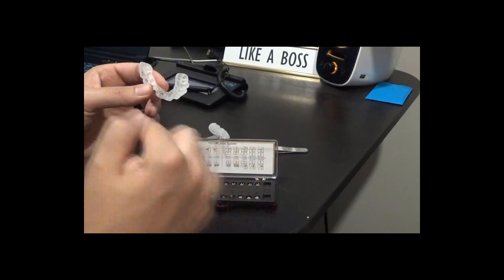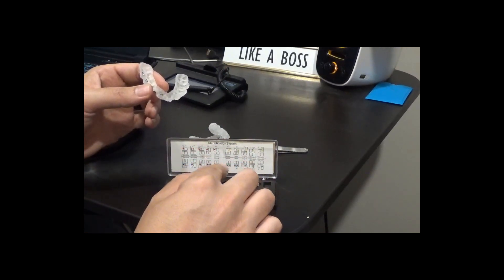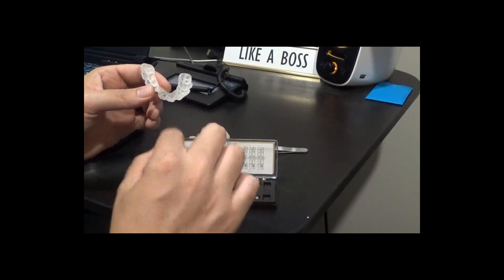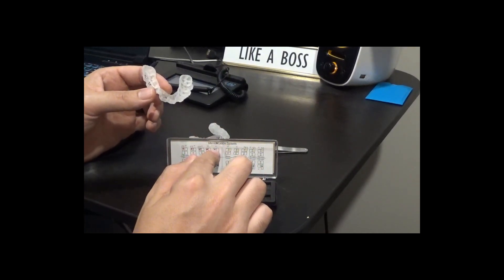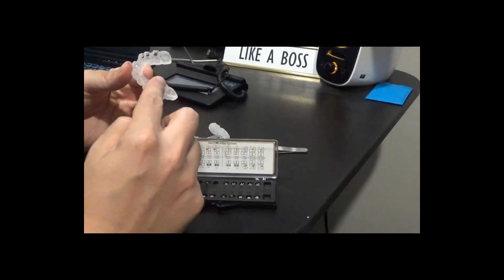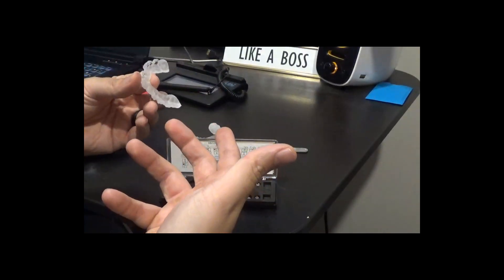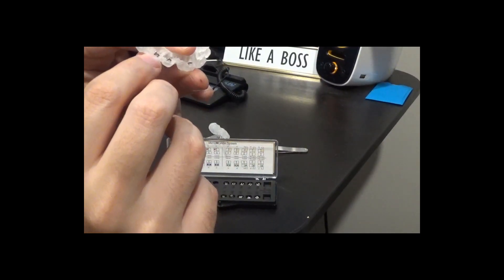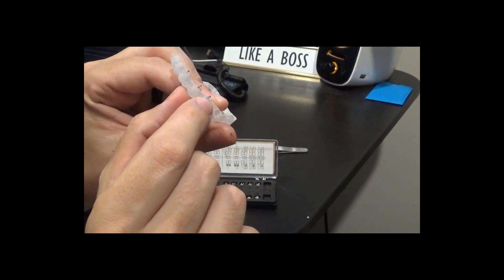Your lower incisors usually have identification dots on both tie wings because they're fairly universal, but for the identification for orientation, it's always going to be on the distal gingival. And because your border of your trays is always going to be to the gingival, your identification dots will always kind of be along the border of the trays, if that makes sense.